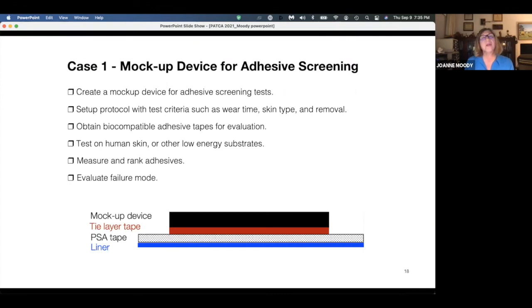There are some companies that will help you, but what happens in the development of these products is that you really need to know how you're going to approach the manufacturing pretty early on, because that makes a difference on what type of vendor you want to work with. There's a whole range of people out there. Some would love to get involved and make your whole product, and some will send you to people to work with. There's just a range of different ways that you can develop your product. So it's important to focus early on that manufacturing step, which I had in the checklist. Really critical.